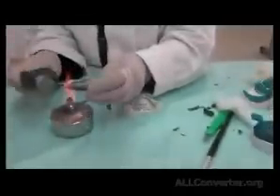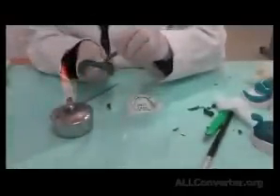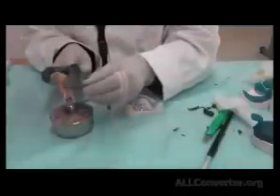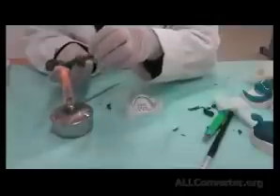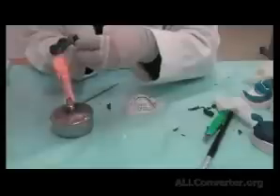On the other side, one by one, drawing out the border, going with the sticky layer first, adding a bulk of material here. So I add a bulk. I need a sufficient amount of material here.